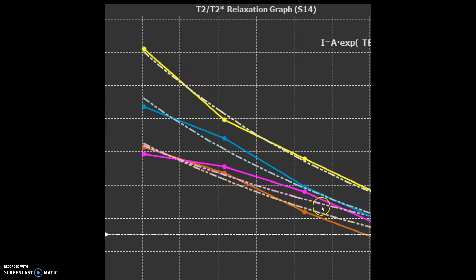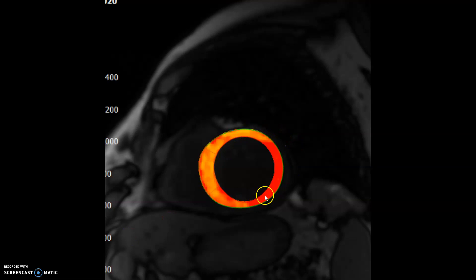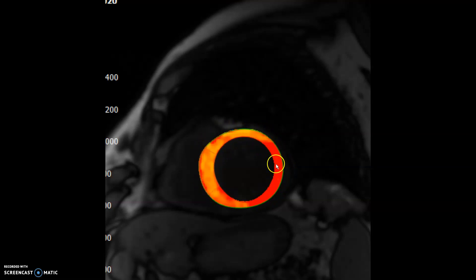When you get the T2 values, they're pretty high — above 100 for most of them. And on the T1 map, the T1 values on this side are above 1,200. They're less over here, but this is more of a global phenomenon — the whole myocardium has inflammation going on.